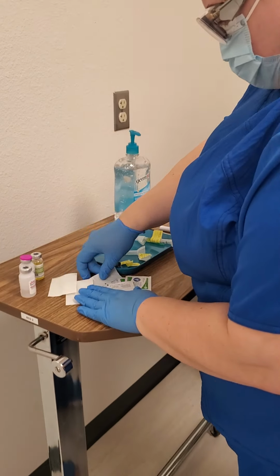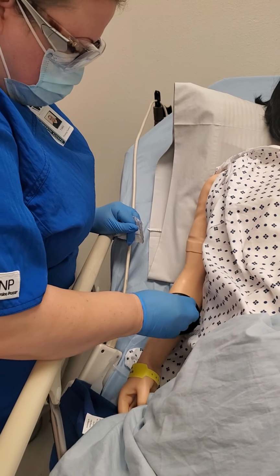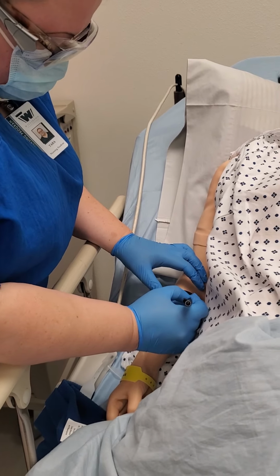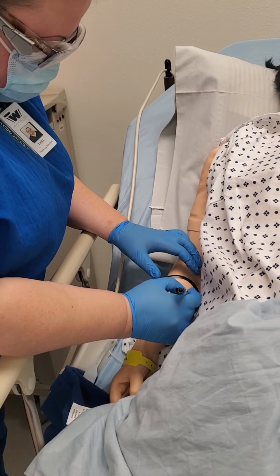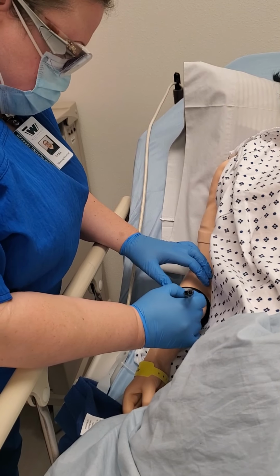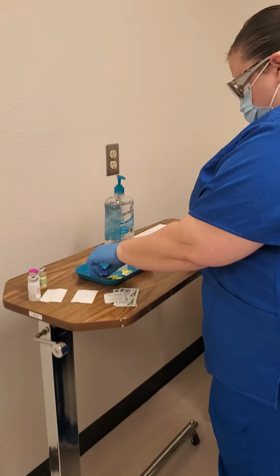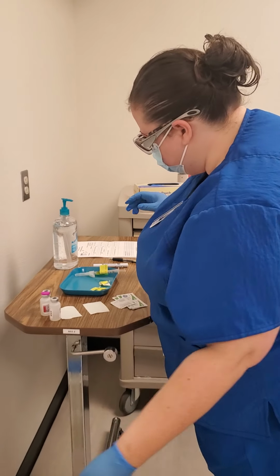Okay, and then I'm going to take my gauze pad, just pat her on there. Make sure that is okay. And then I'm going to circle the blip here with a pen, and then I'm going to put the date. So it'll be 10/19/20. The time, 10 a.m. And then my initials, which the pen doesn't work so good, but it's all on there. See my circle. Okay, and then I'm going to document everything on my paper that I administered injections.